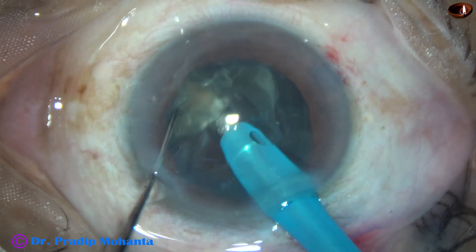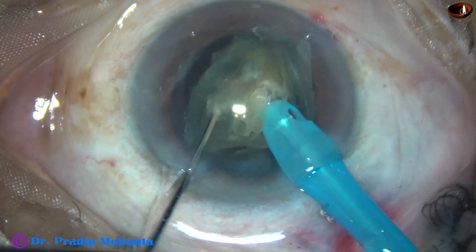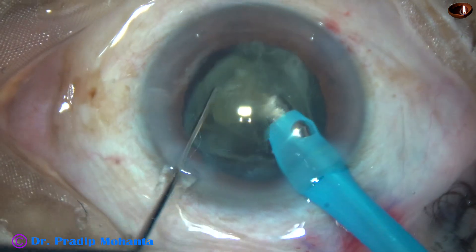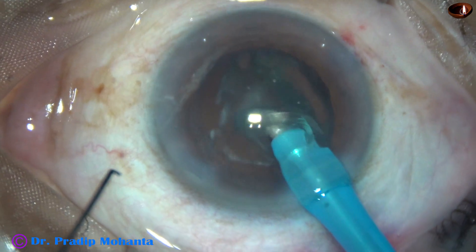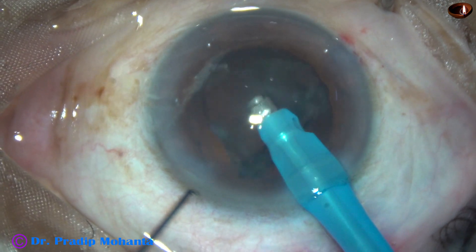From all the fragments, only the nucleus has been emulsified and the epinucleus is remaining. And now I go to phaco 3 mode — the epinucleus removal mode — and the epinucleus is nicely removed.